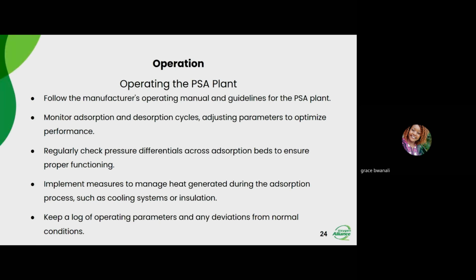So we monitor the purity levels for some time. If we see that the produced oxygen is having low levels, not the recommended level, which is supposed to be 93 plus or minus 3, we dump the air to make sure that we have the average values.